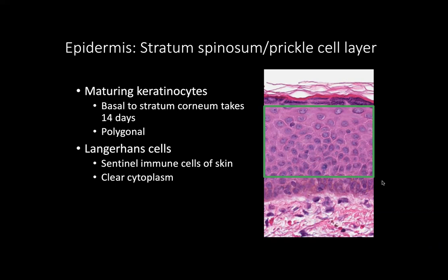And that's a part of the optical mileage that I mentioned in the last lecture, that you have to look at a lot of epidermis to really get a good sense of it.